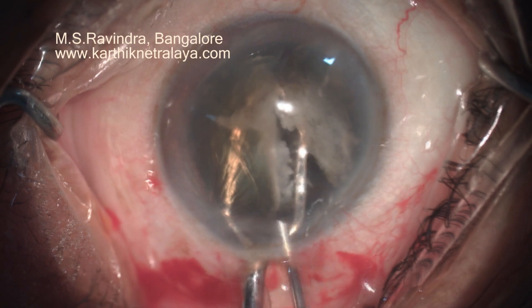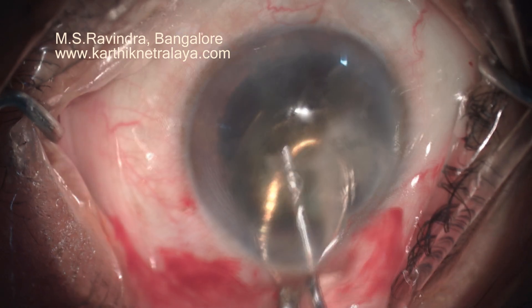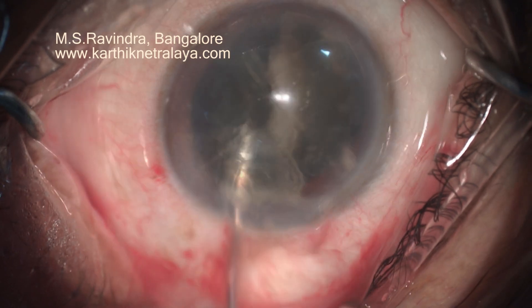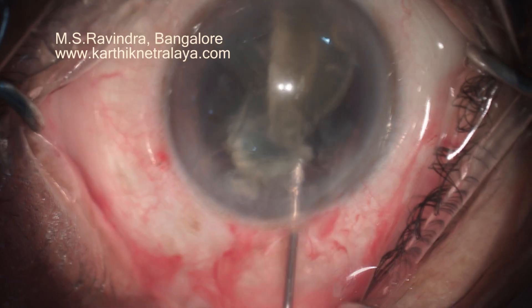Scoring of the lens is done through a 25-gauge cannula, which is injecting visco continuously, separating the nucleus from the endothelium.